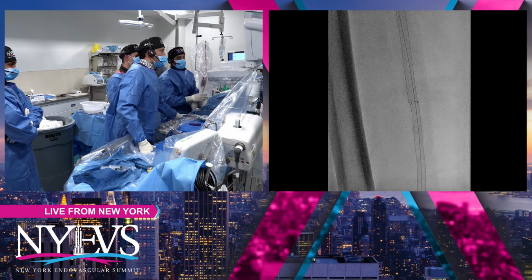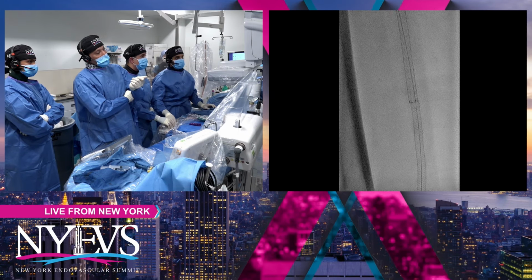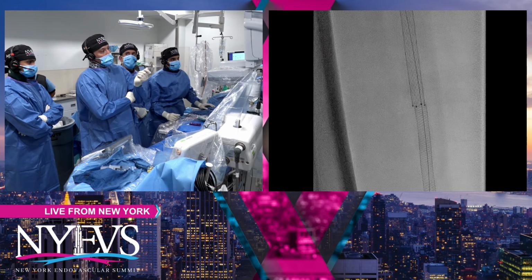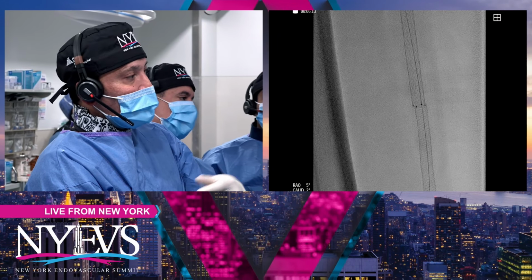You can fluoro it, Raman. Yeah, you can see this. So you see right this part where the overlap of the stents is. That's the midpoint where there's a lot of restenosis. Looks like when they deployed the stents, they must have probably missed it, just by a millimeter or two. Like a millimeter or so, looks like.